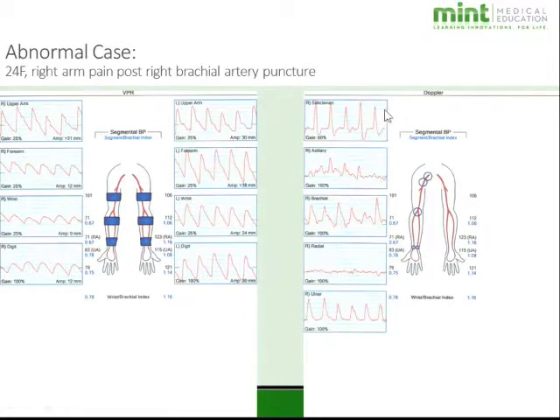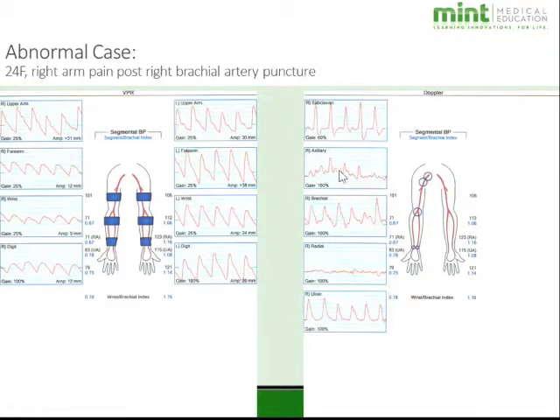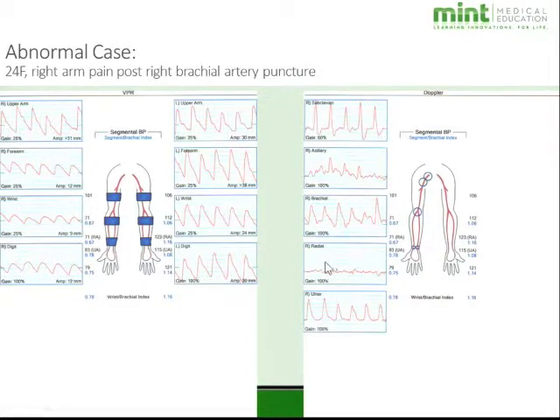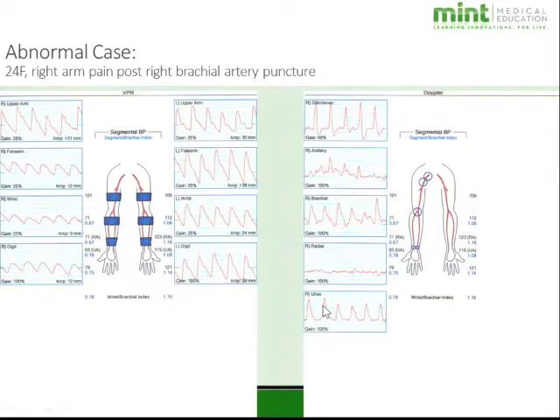Looking at the same patient's Doppler waveforms, we see multiphasic flow proximally, but the radial artery is nearly flatlined. However, there is pretty good ulnar artery flow, suggesting near occlusion of the radial artery, possibly with some collateralization through the ulnar artery.